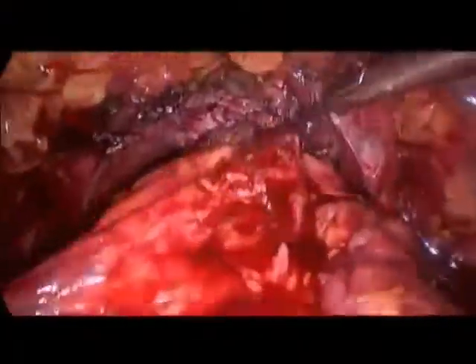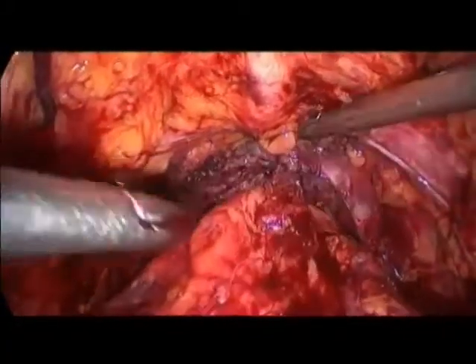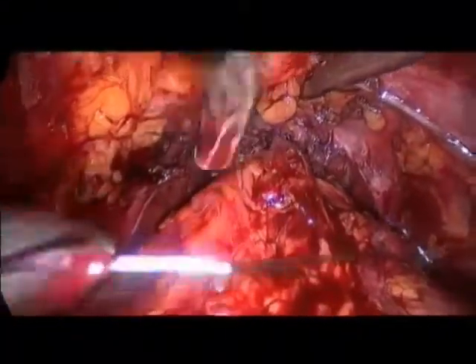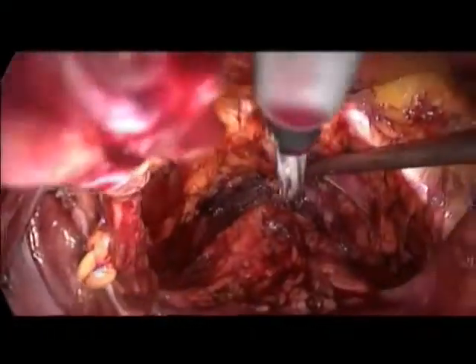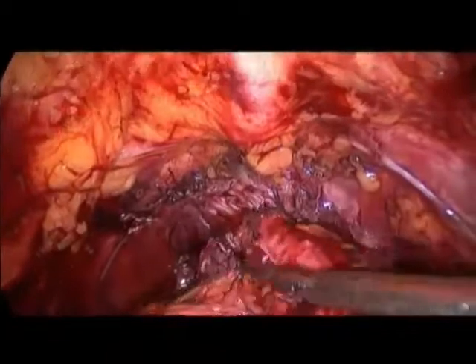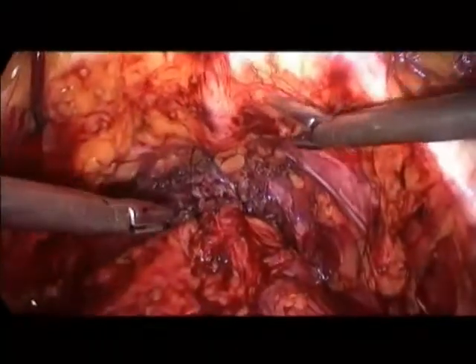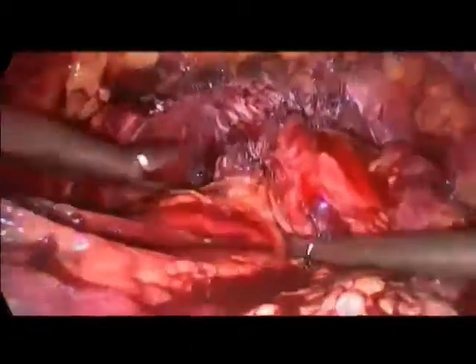Zoom in. Yeah. And are you performing a cystogram routine? Yes, we still do just that. Take out the catheter. And we have 2% of leakage at the cystogram, needing additional days for catheter, but otherwise we generally have a watertight anastomosis. What are your ideas about suspension stitches? No, we don't do that. I have no idea about the usefulness. You have seen that we have made some suspension of the posterior aspect of the sphincter, but beside this, this is not tight.